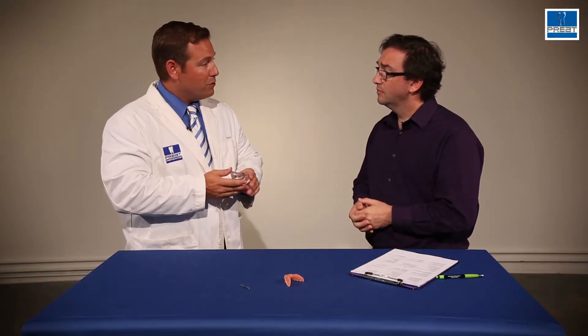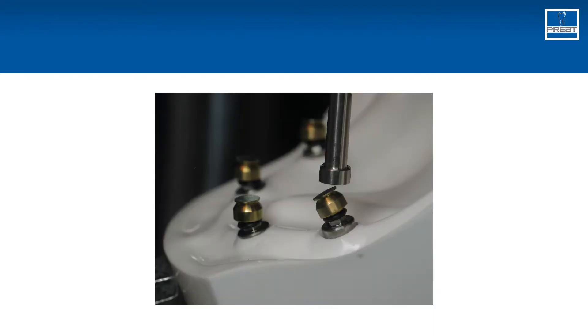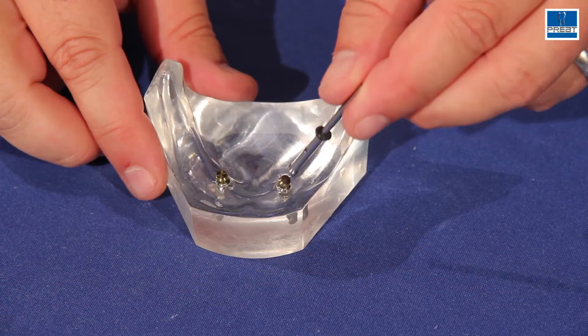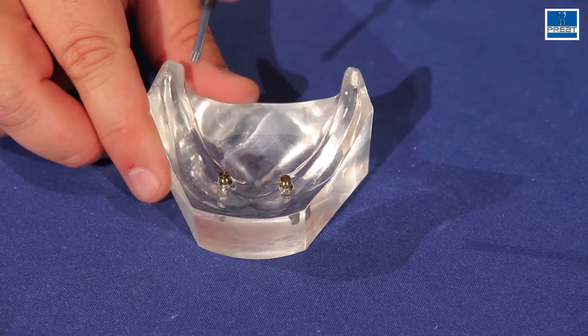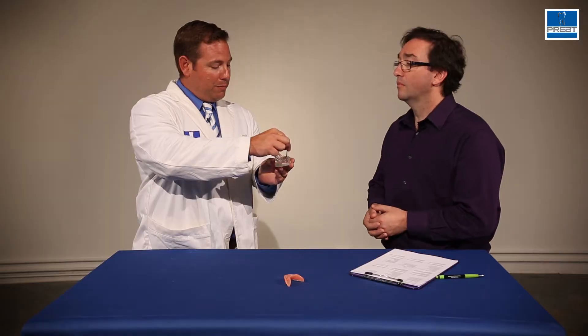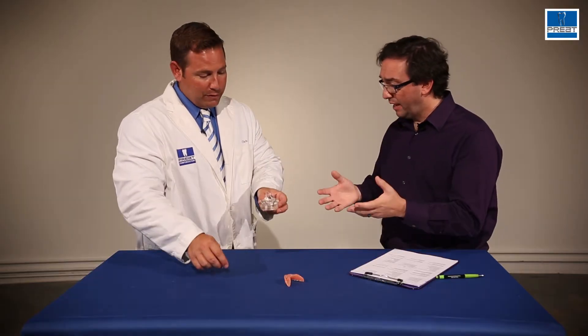That makes a lot of sense. How do you get them parallel? So there's two ways you can do it. One is in the laboratory. We have a laboratory mandrel that goes in the surveyor, and once you find the path of insertion or the draw you want for one, move it over to the other, and you can simply rotate and parallel using the paralleling mandrel. Okay, so that's at the lab? Exactly.